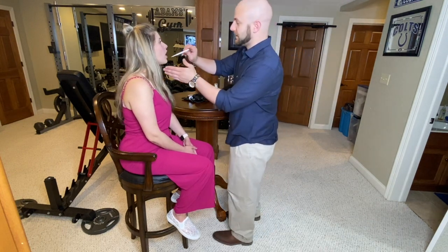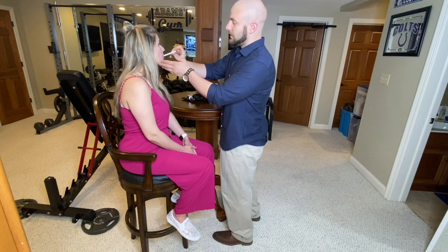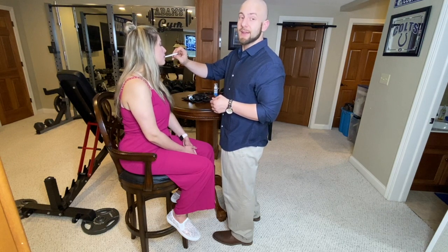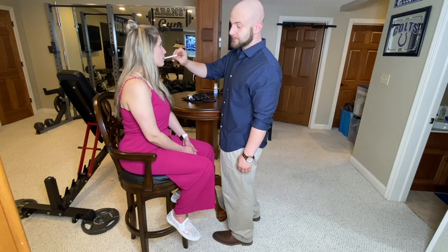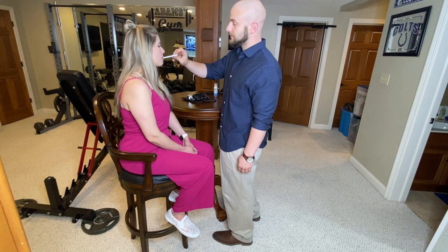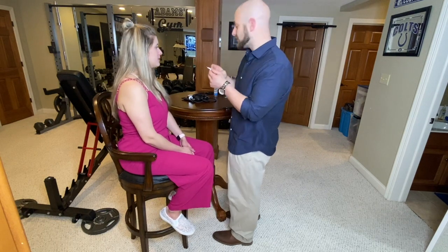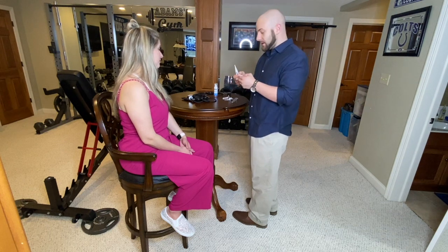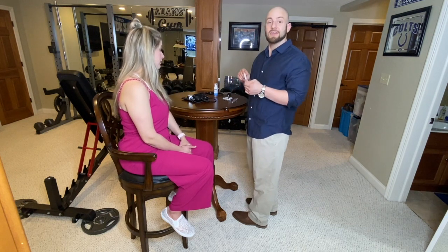I'm going to go ahead and place this underneath your tongue. We're going to hold it there until you hear it. And a healthy temperature for a grown adult would be 96.8 to 99.5 degrees Fahrenheit. Your temperature is at 96.7, so it's still within the healthy range. That's great. Next, I'm going to clean it off with the second alcohol pad. Her temperature is at 96.7 degrees.